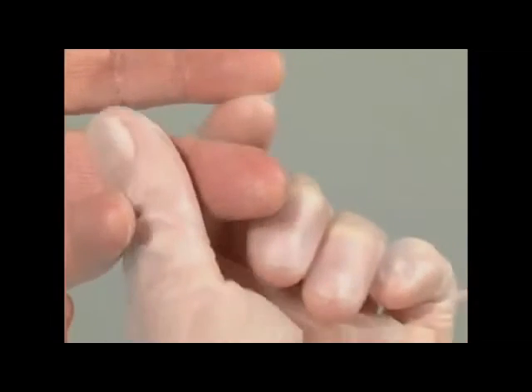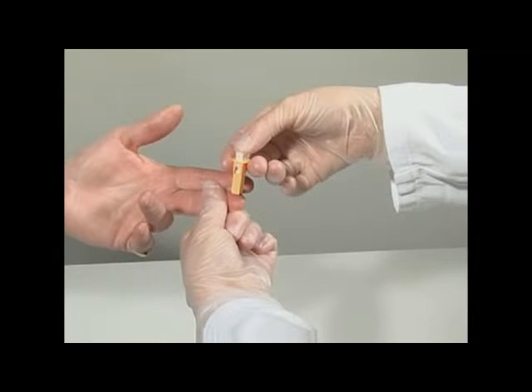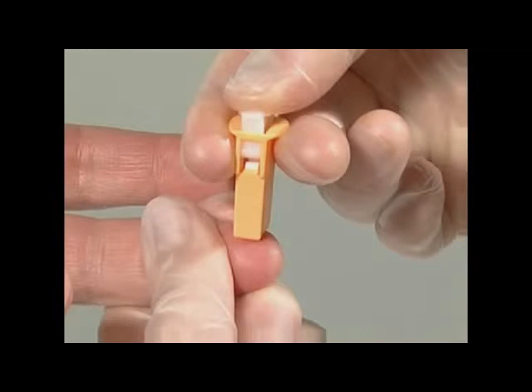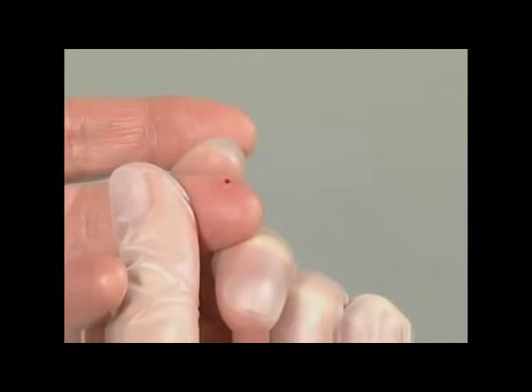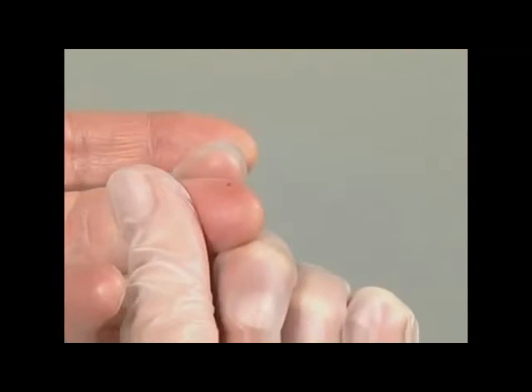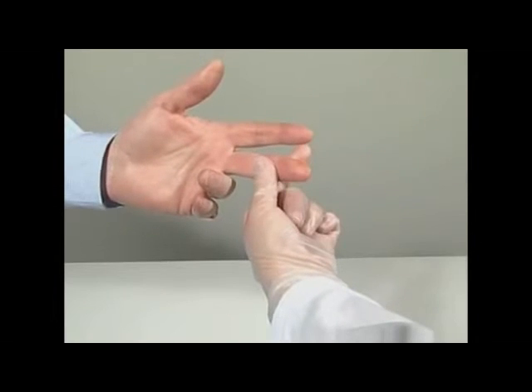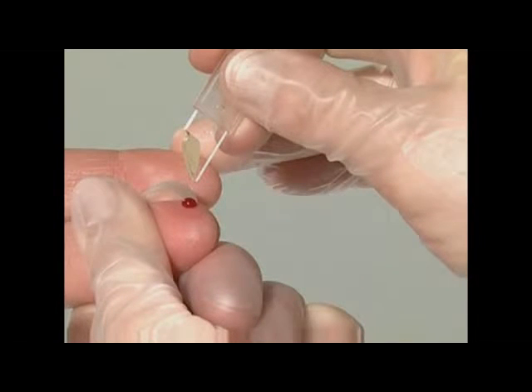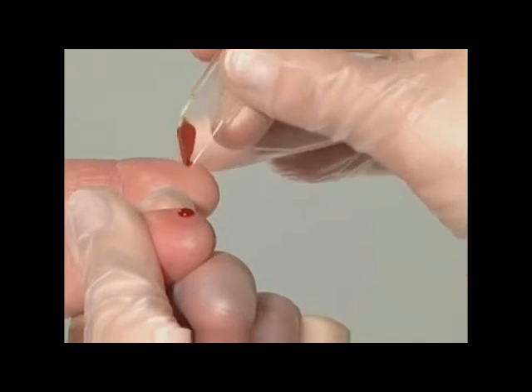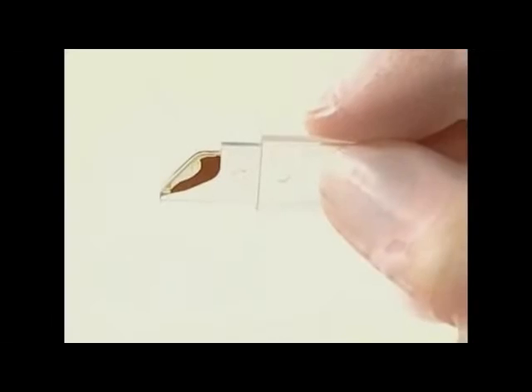Using your thumb, lightly press the finger from the top of the knuckle towards the tip to stimulate blood flow towards the sampling point. For best blood flow and least pain, sample at the side of the finger tip, not in the centre. Whilst lightly pressing towards the finger tip, prick the finger using a lancet. Wipe away the first two or three drops of blood. Reapply light pressure towards the finger tip until another drop of blood appears. When the blood drop is large enough, fill the micro cuvette in one continuous process. If the cuvette is not completely filled, discard it and fill a new cuvette. Do not refill.